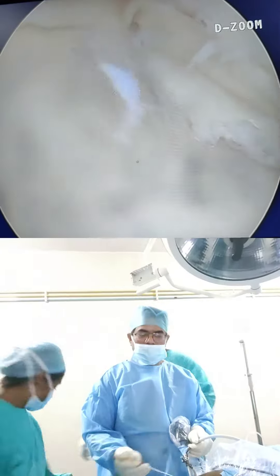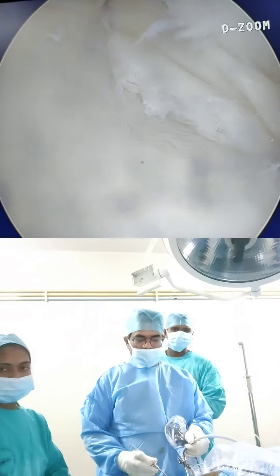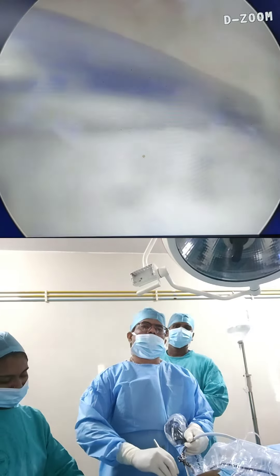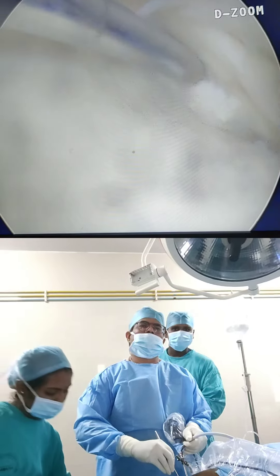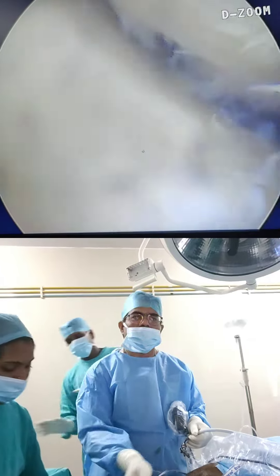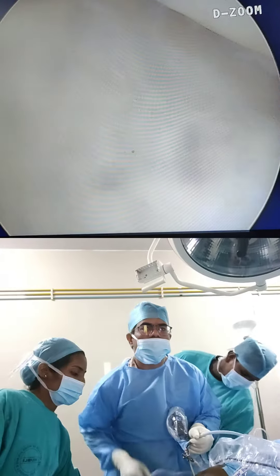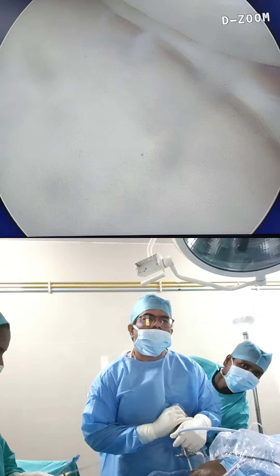Probe. Now we will push this edge into the joint. Now see, it is reduced — the tear is reduced now. Previously it was outside, and now it has been brought back into position.